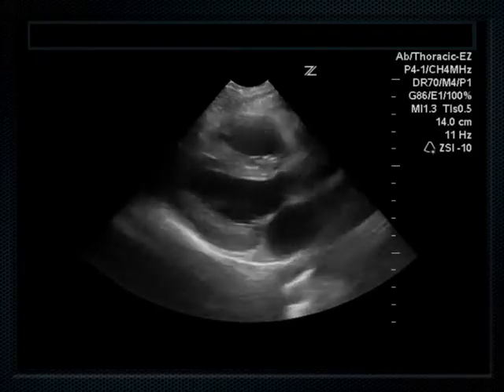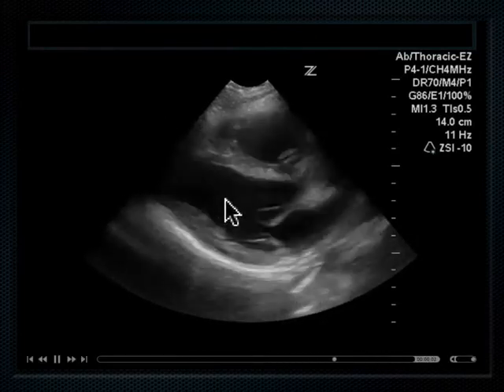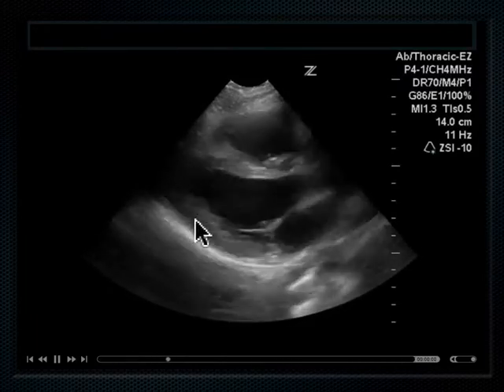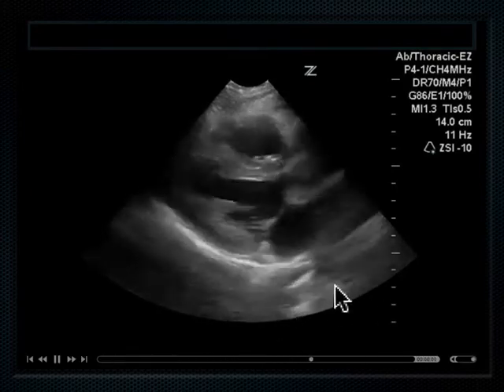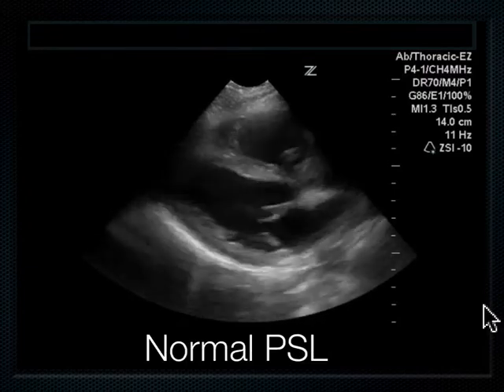But I like this particular heart here. This is a little tachycardic. LA, LV, aortic outflow tract, RV. That's the interventricular septum, and this back here is the posterior wall. I don't know, I can't really see the descending aorta. It's sitting around here somewhere. I'm not seeing it very well in that view there. But this is just a normal parasternal long axis.